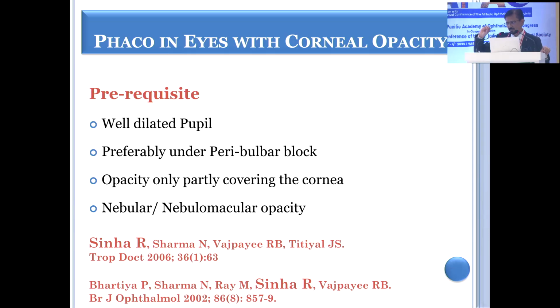Preferably it should be done under peribulbar block because sometimes you have to manage the iris and the patient might have pain. You can use intracameral drugs to reduce pain. And it is best performed when the opacity is only partly covering the cornea and in a nebular or nebulomacular opacity.